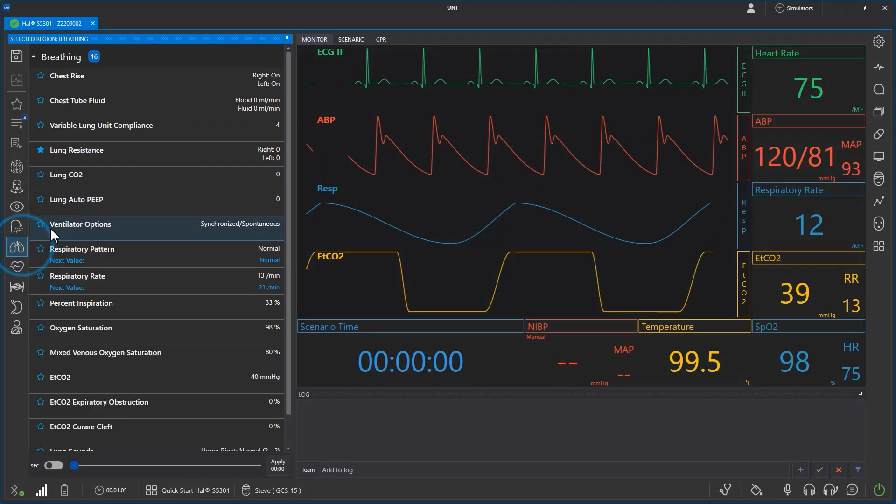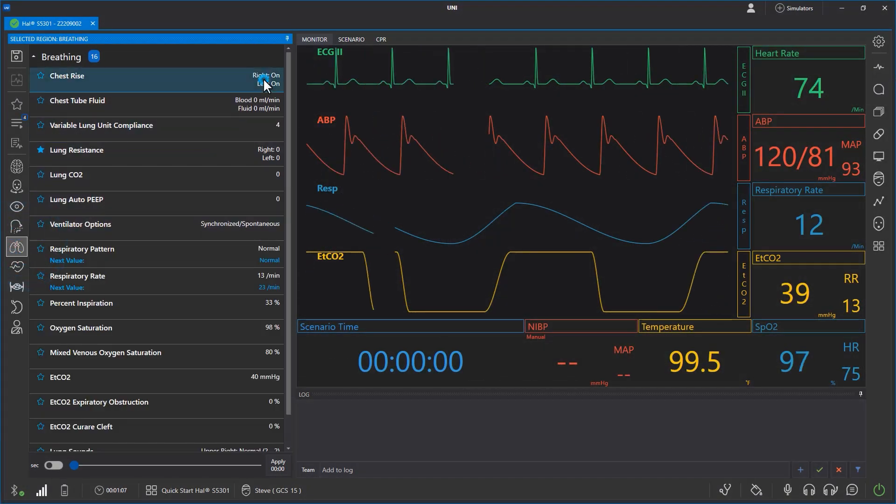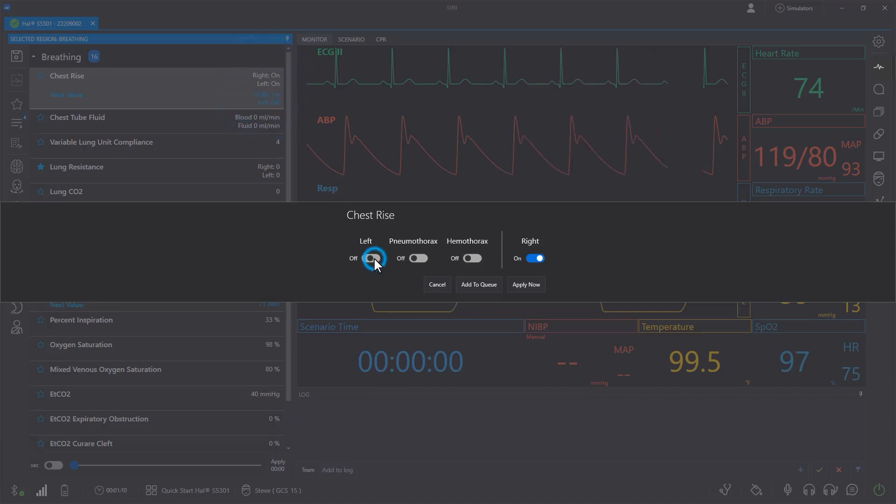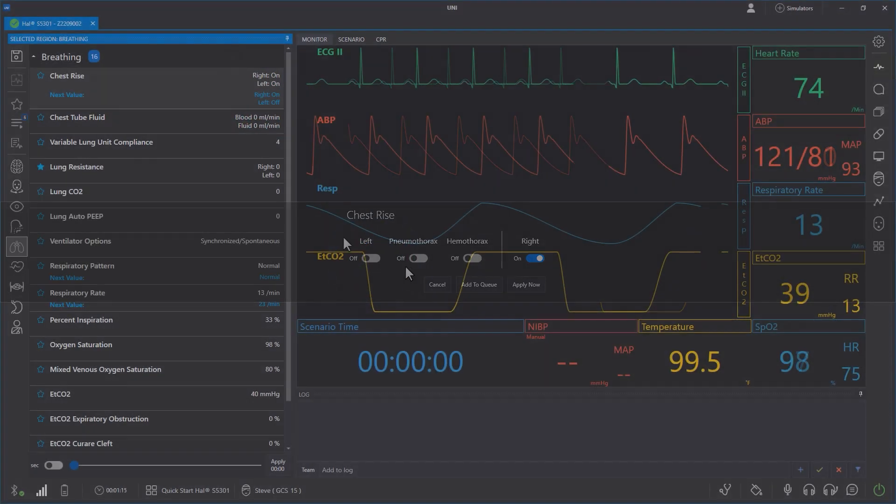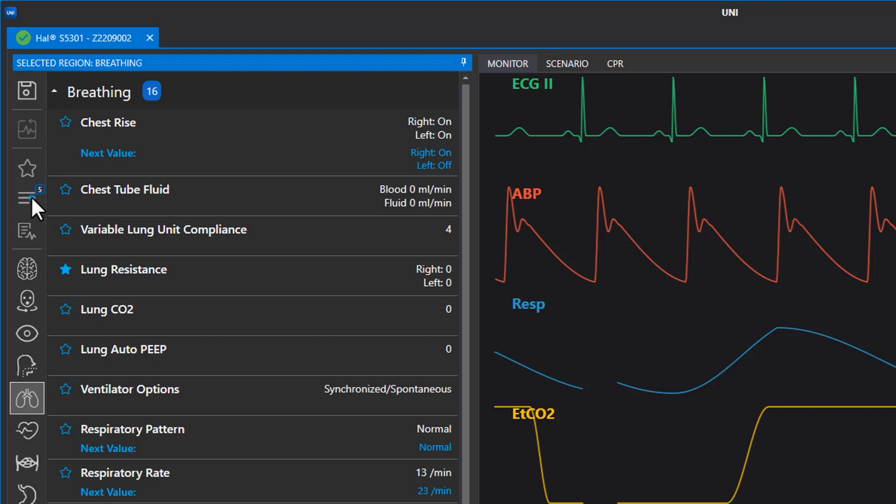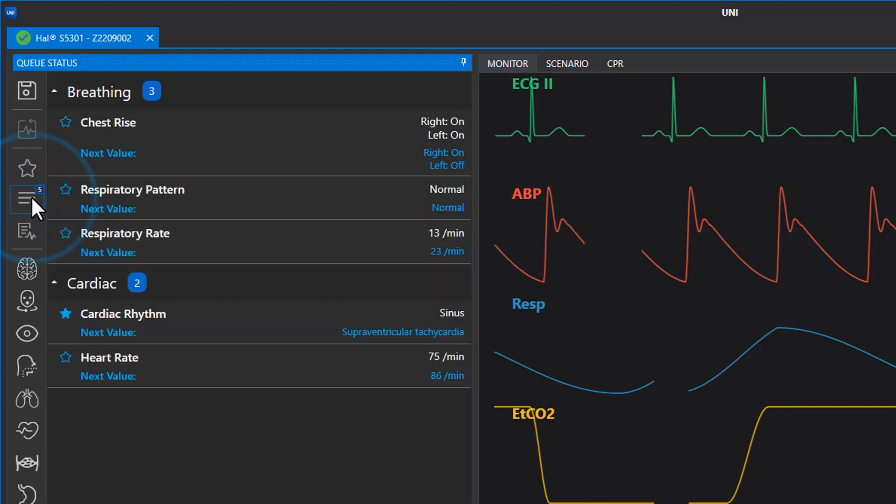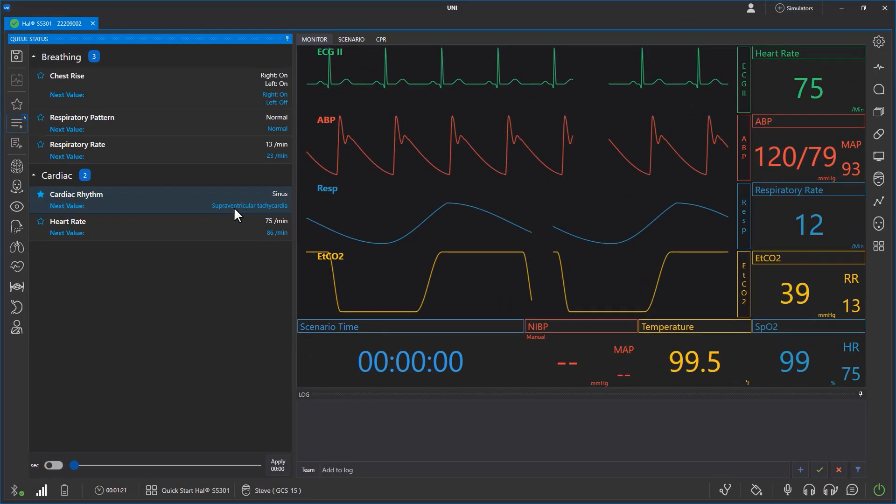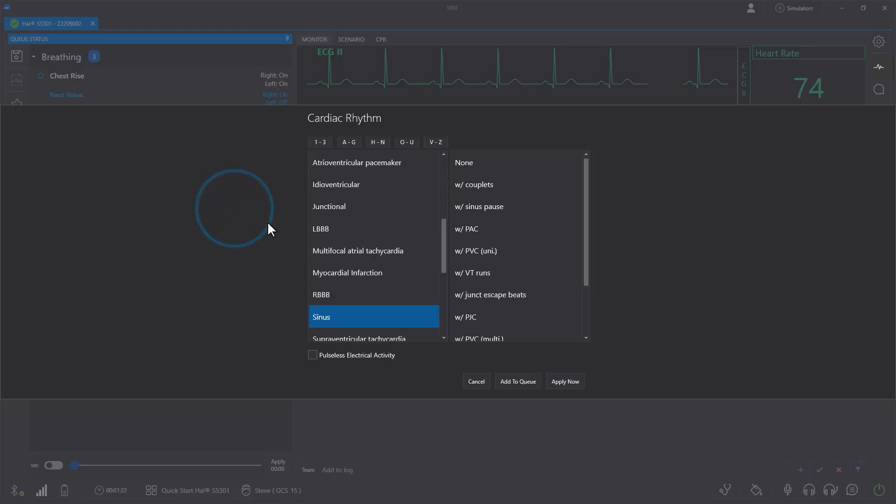Cued vital sign changes can be applied simultaneously with other changes for more intricate and realistic scenarios. To view the set of cue changes, click the Cue menu on the left. From this menu, you can edit changes or cancel them completely.